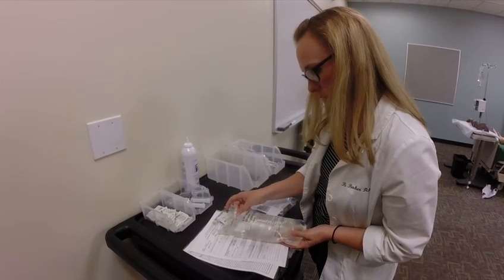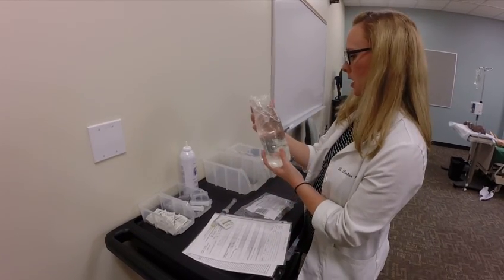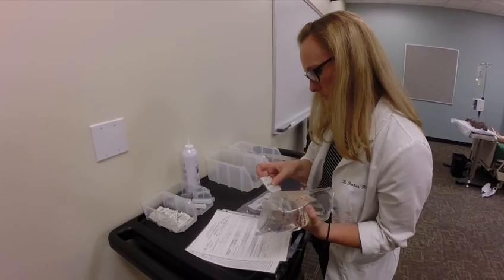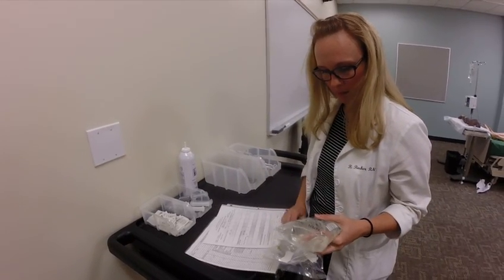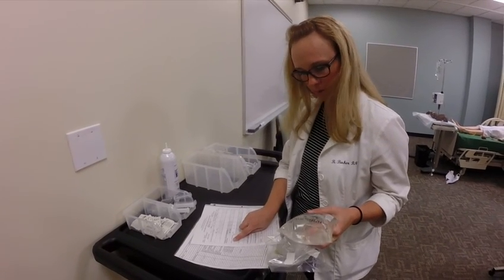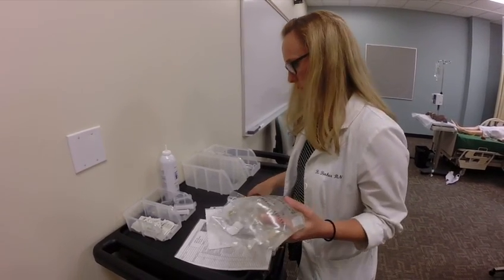NS 1 liter bag, and that's what I have. And then I'm going to go ahead and do my second check, grab all of my stuff. I've got my sodium chloride 0.9%, 1 liter bag, and that's what I have on my MAR.